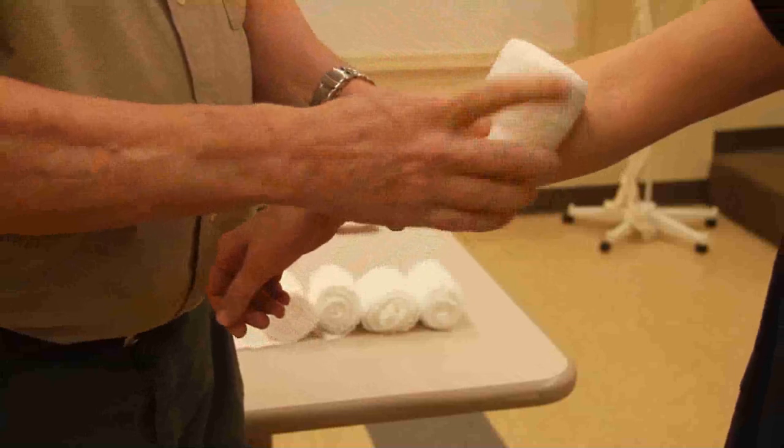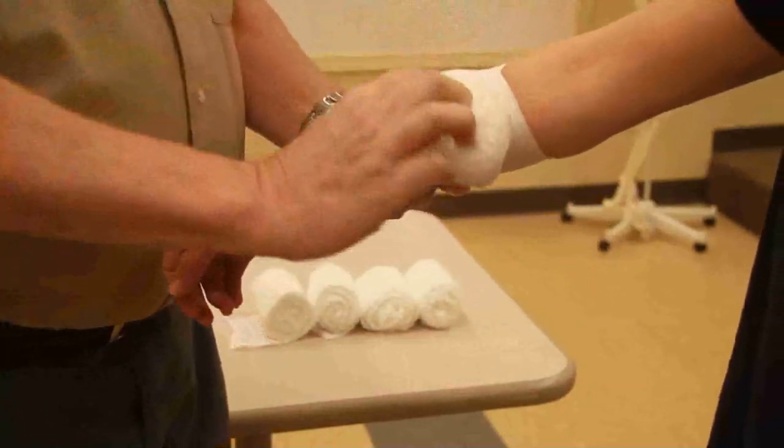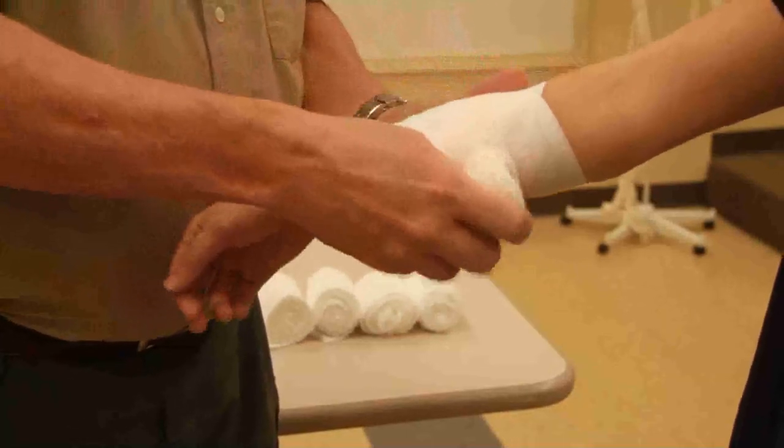I'm going to be moving the wrap distal to proximal, proximal to distal. I'm going to make this look a little pretty.